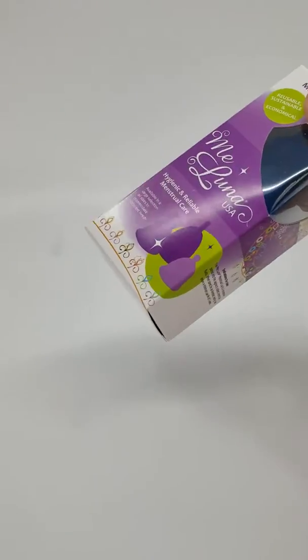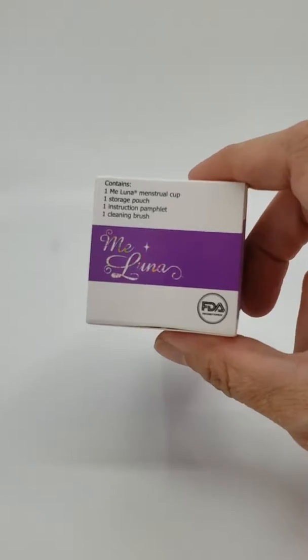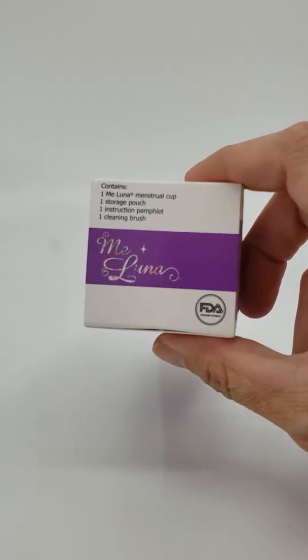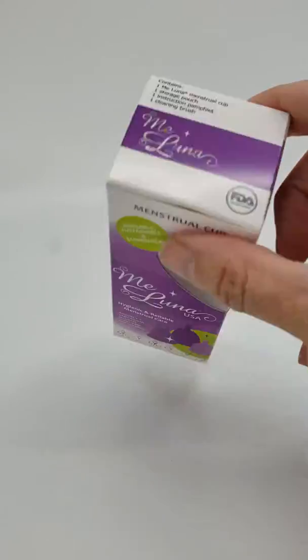I'd like to show you what comes with your Meluna when you get it in the mail. You can see on top of the new packaging that you will get your Meluna with the menstrual cup, the storage pouch, the instructions, and a cleaning brush.